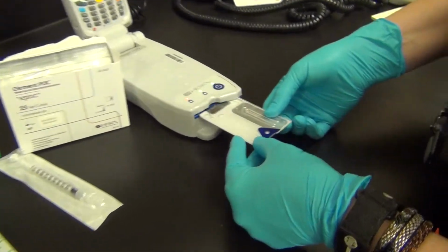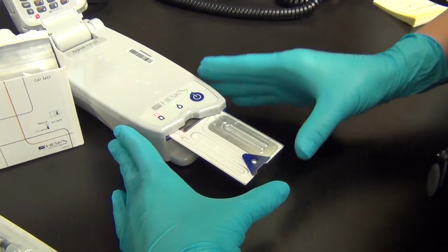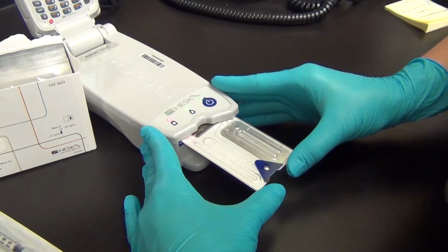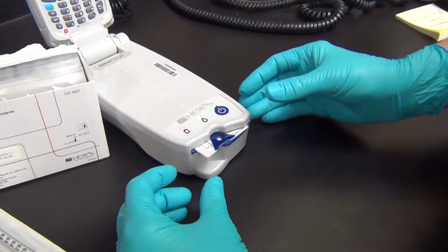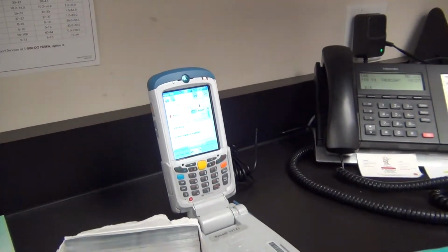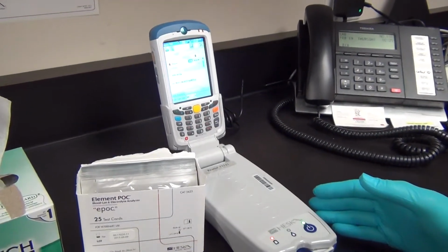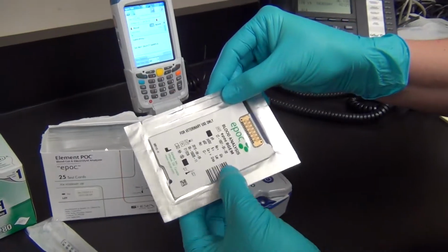We're going to slide it into the bay with a quick, smooth insertion and a firm click at the end, and it's going to read the calibration barcode, so insert it quickly and fully seated. It will display on the screen that it's read the barcode for the card.